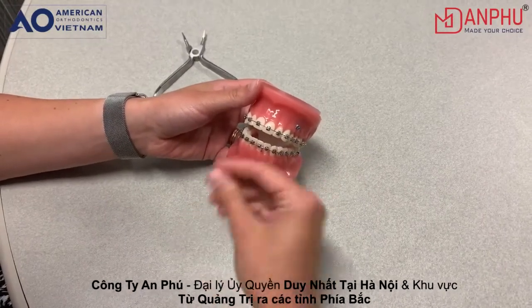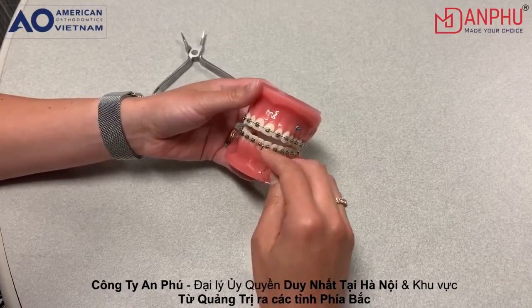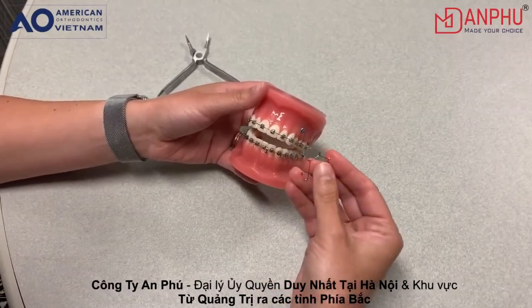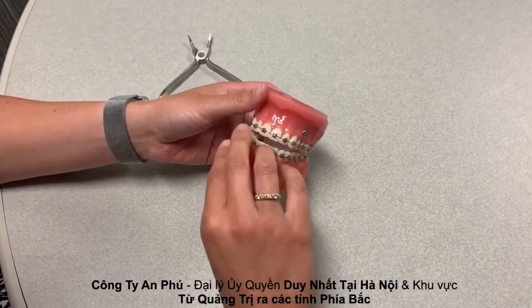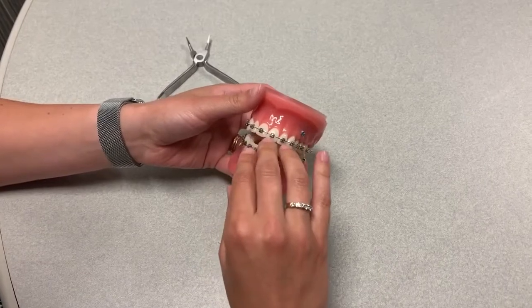We're going to demonstrate installation of a maxillary medium art spring onto this typodont. Maxillary medium is the most popular size. In this example, we're going to assume that this Empower patient requires detorking of the upper arch.